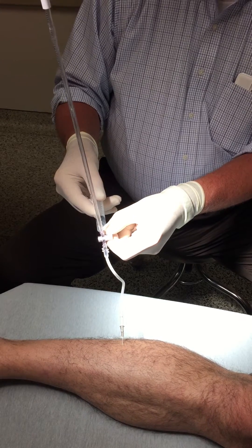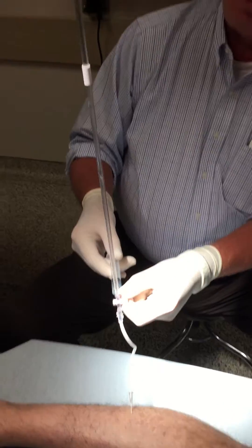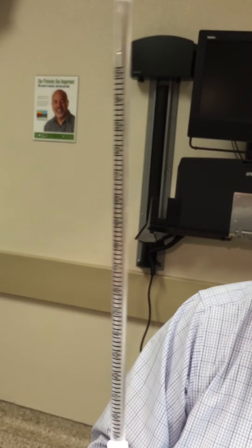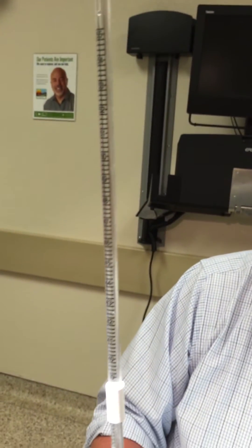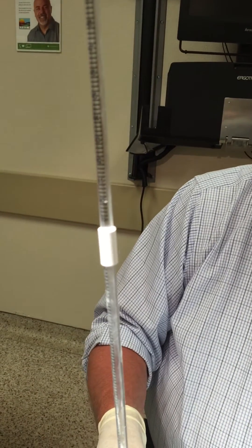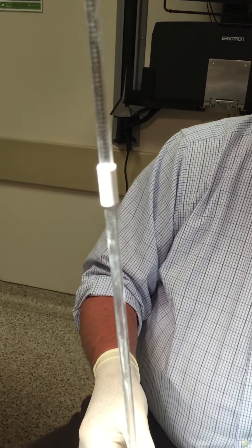I'm going to check our compartment pressure. You can see our meniscus is dropping, dropping on down. You're good, you're good — I can see the meniscus. Are you feeling any pain with this at all? No, I'm not. Good. Thank you for asking.